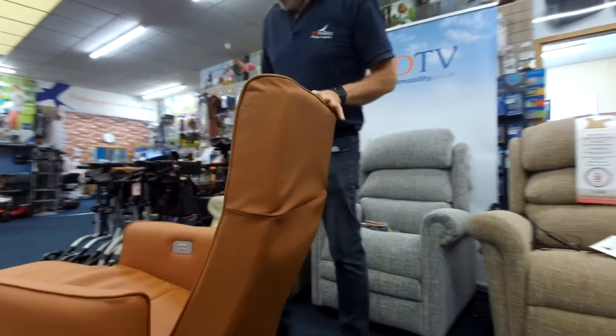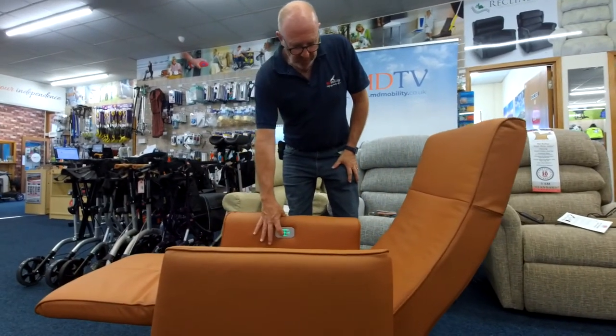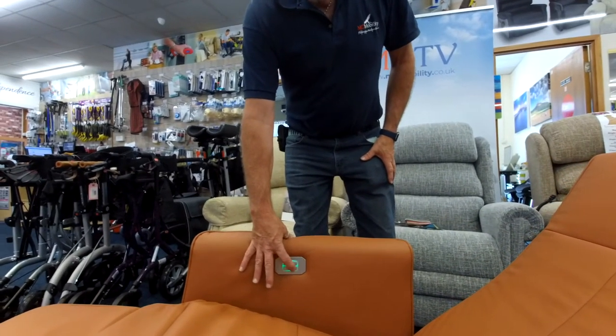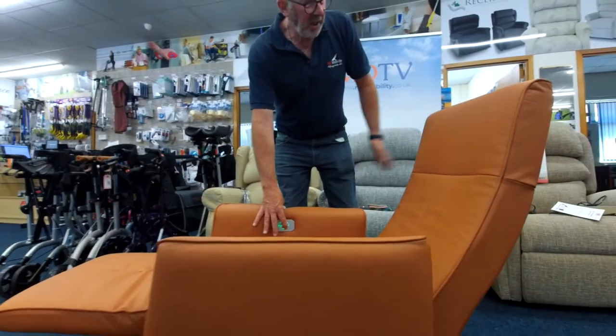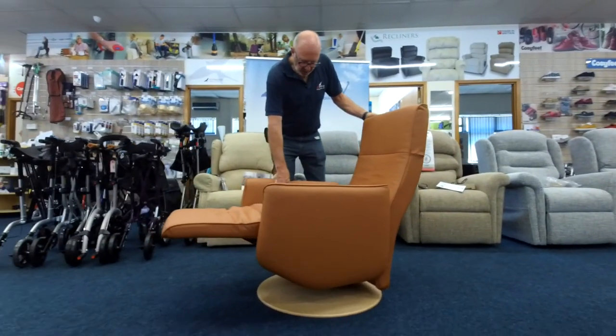Coming back to these buttons again — you can see the backrest goes up and down. You can actually have the backrest going up and down when the chair is in the upright position as well, so you don't have to recline first. As you can see, I haven't quite got used to these buttons yet, but it's like anybody else when they get a new chair — after a few days you soon work out what's what.